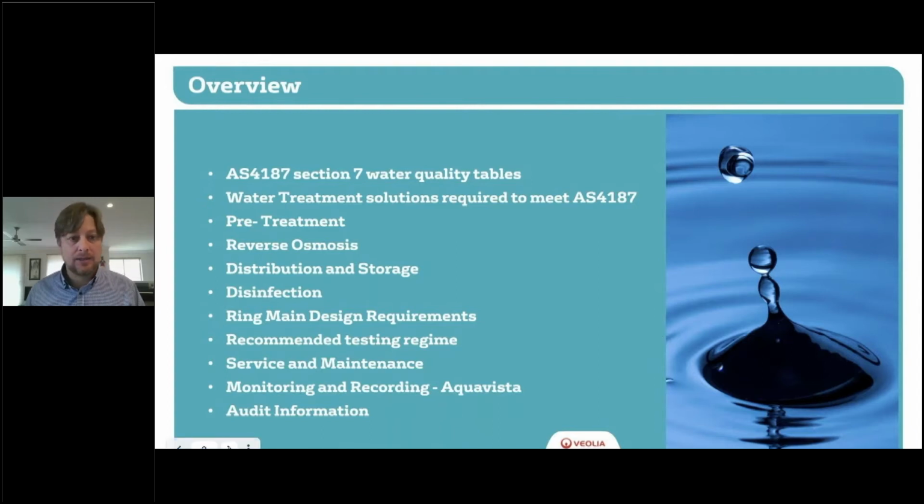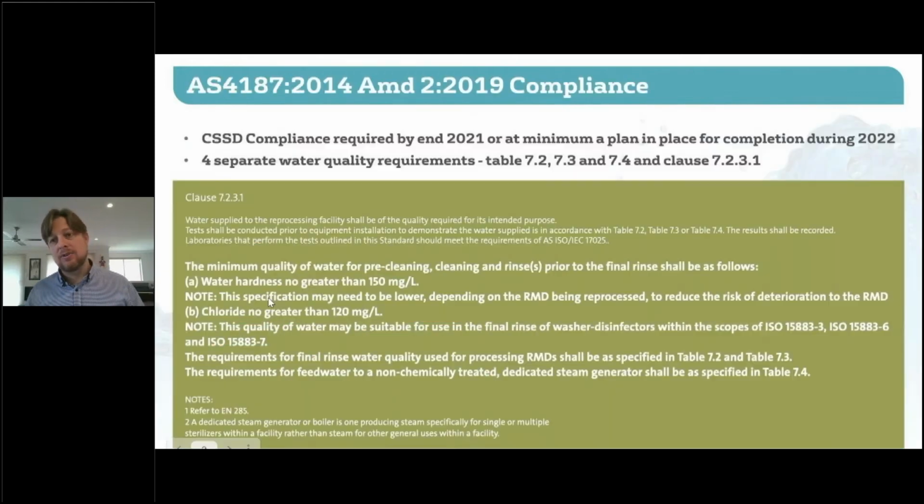The one thing that's come out more recently in regards to this standard is that the CSSD compliance was required by the end of 2021, but as of last year they've revised that to say, at minimum, a plan is in place for completion during 2022 or beyond.